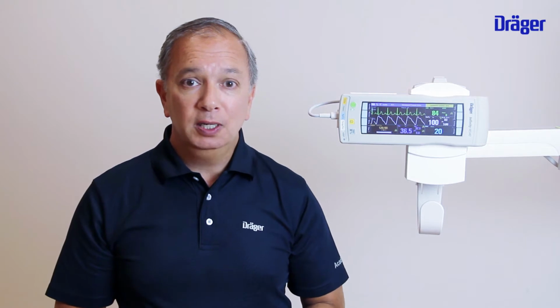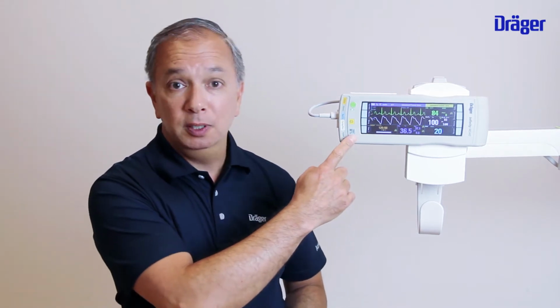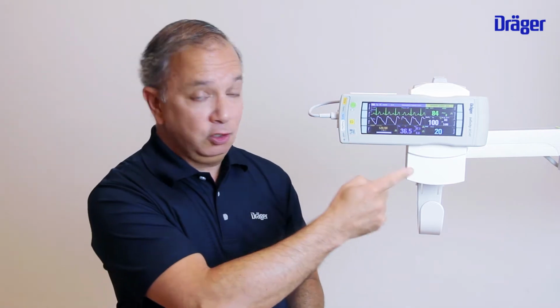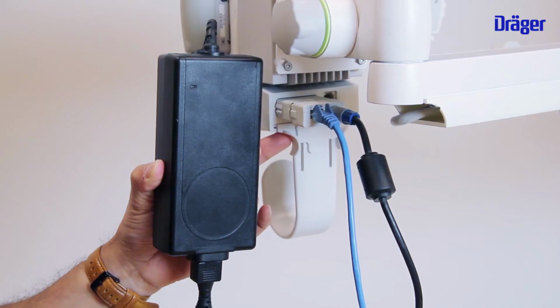The M540 Standalone has three components. The first component is the M540 patient monitor. The second component is the M500 docking station, and the third one that you need is the power supply.